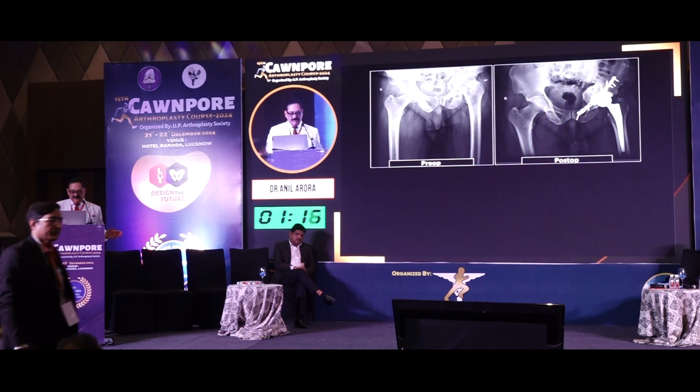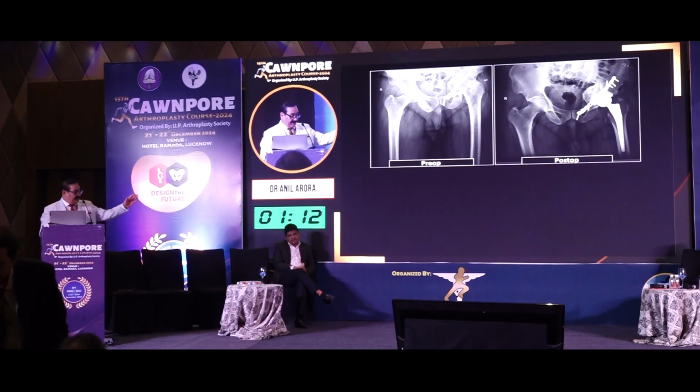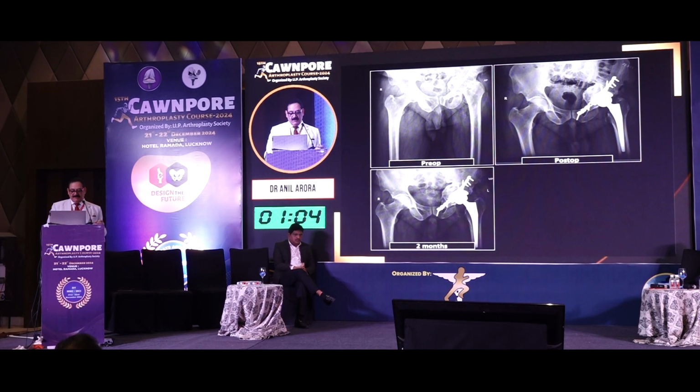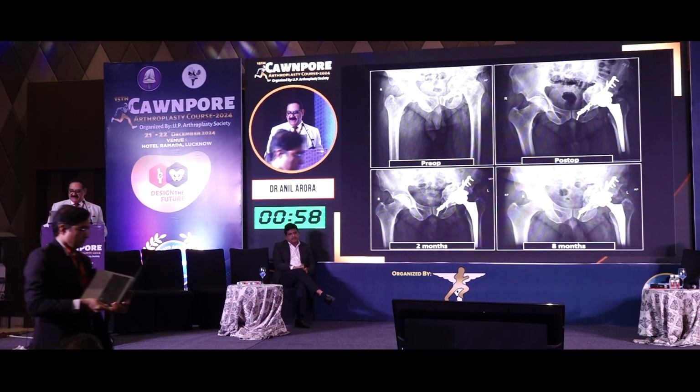This is preoperative, and on the right is postoperative. You see, it is immediate postoperative. You can see the staple, but see the bone graft, it looks consolidated, immediate post-op even. 2 months follow-up, and again 8 months follow-up. Patient is doing very well. It's almost now 5 years.